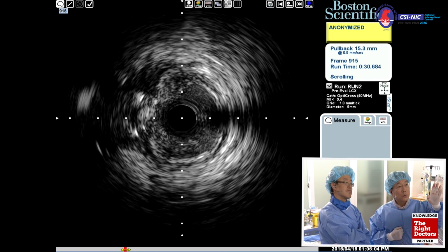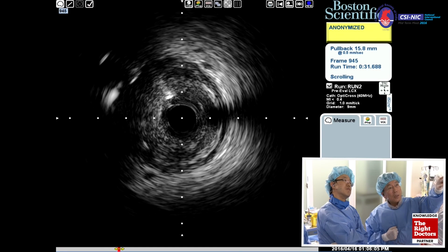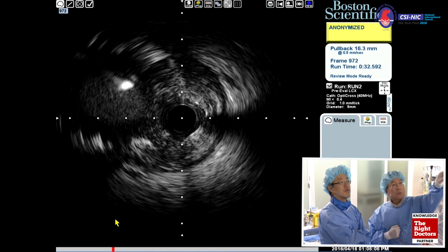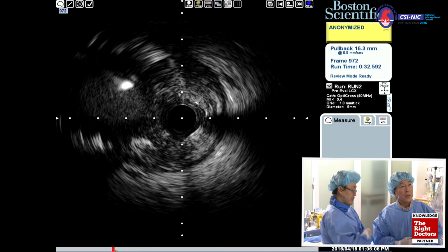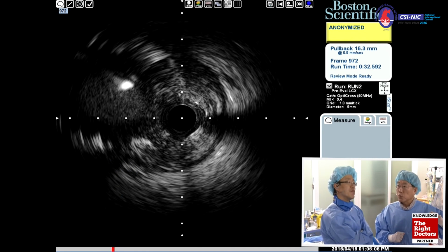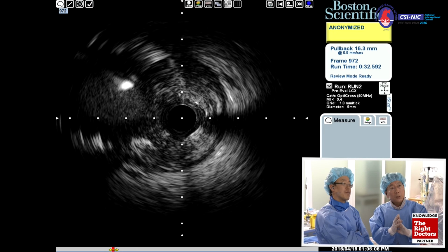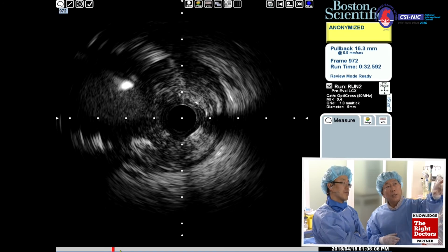Go ahead, one or two segments. LAD wires, we can clearly see at 10 o'clock merge with the main. Two wires, stop. That one is at 11 o'clock. At 10 and 11 o'clock, another wire from the LAD joins and merges with the main here. And look at this circumflex ostial part, lots of plaque over there, right? Quite big, three of them. And very focal, very tight stenosis, plaque vulnerability maybe related. Go ahead.